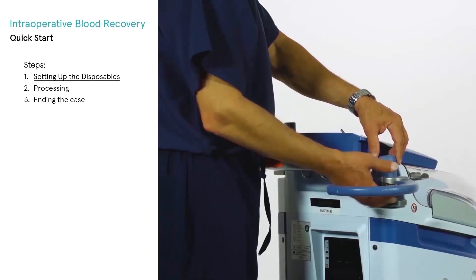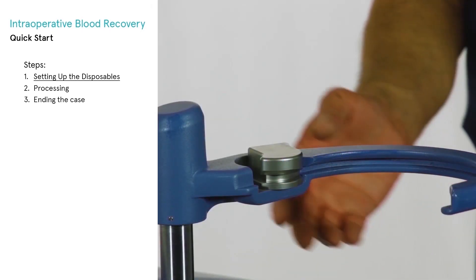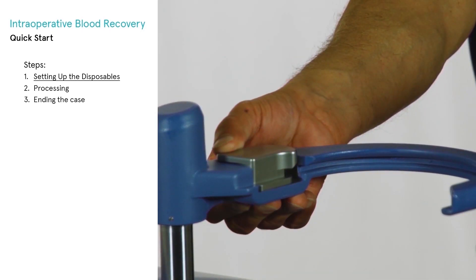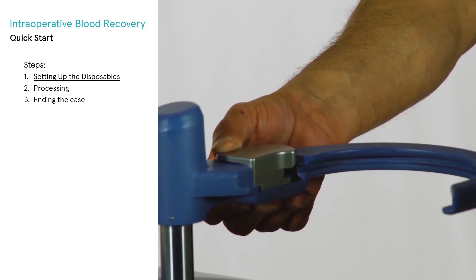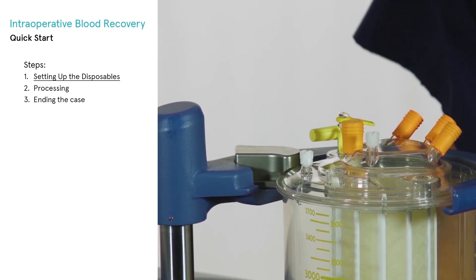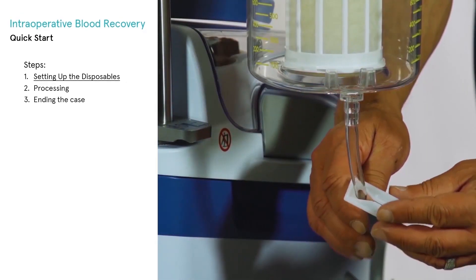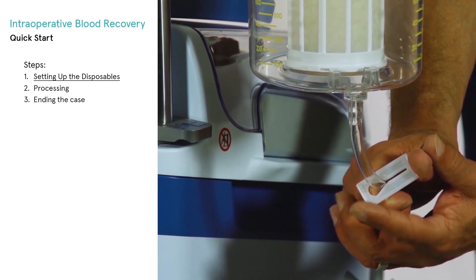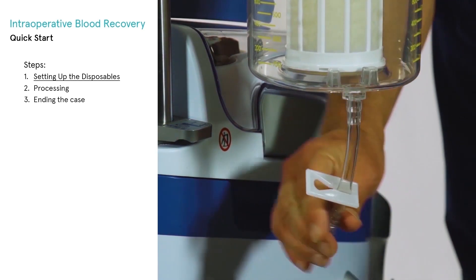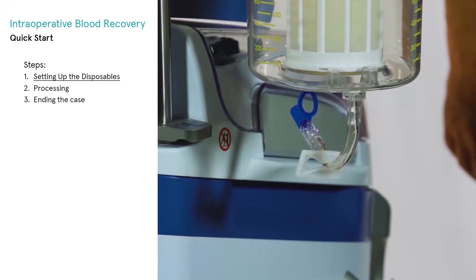Swing open the reservoir holder and raise it to the desired height. Keep the locking clip on the reservoir holder open. Slide the edge of the reservoir lid into the slot of the holder and push the reservoir into position. Close the clamp on the bottom outlet line; it will be reopened when connecting to the prime line of the bowl set when it is time for processing.